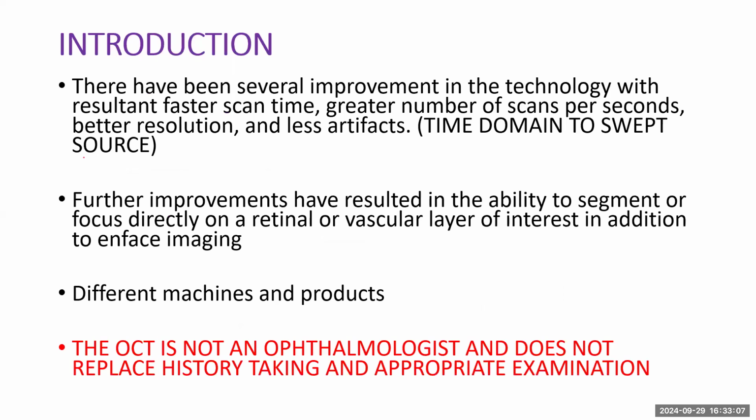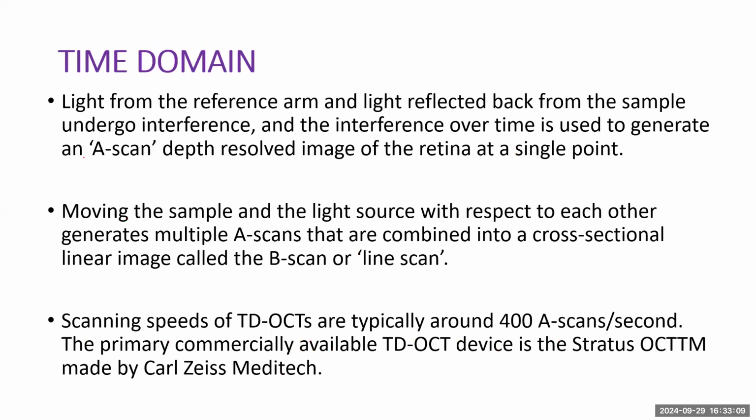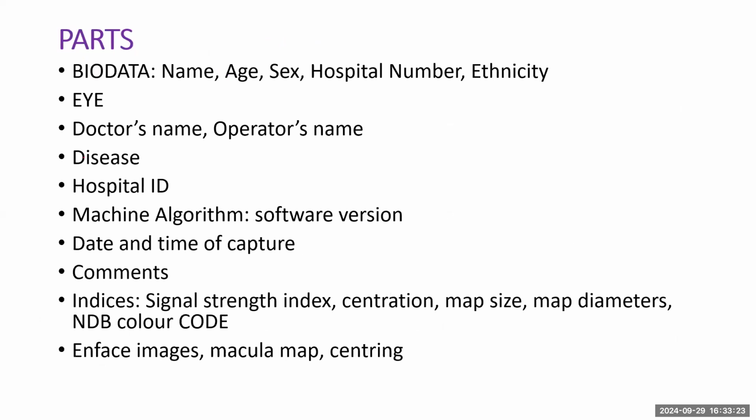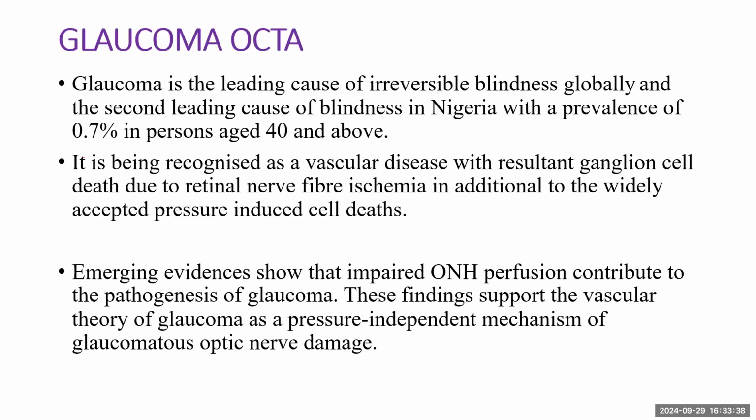We said that day that the OCT is not an ophthalmologist and does not take away clinical reasoning, history taking, examination, and judgment calls. For the OCTA, the printout and parts are still the same, containing the following features listed here.